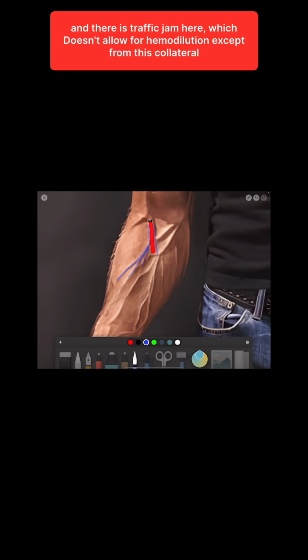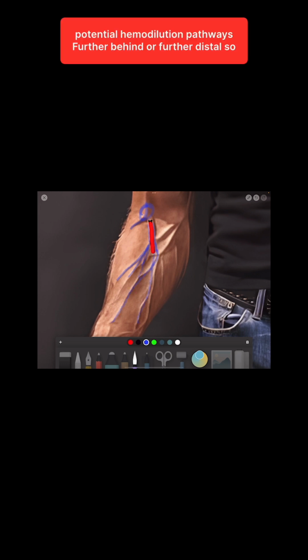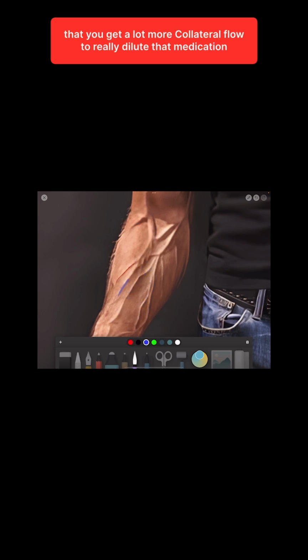And there is a traffic jam here, which doesn't allow for hemodilution except from this collateral flow. So this collateral vein is what's helping to dilute it, but you're missing out on all these other potential hemodilution pathways further behind or further distal, so that you get a lot more collateral flow to really dilute that medication.